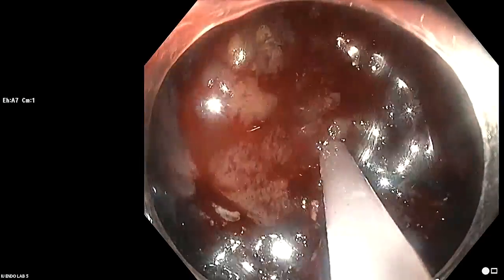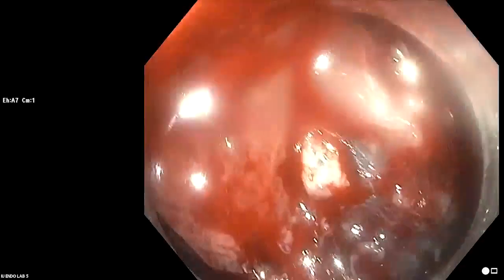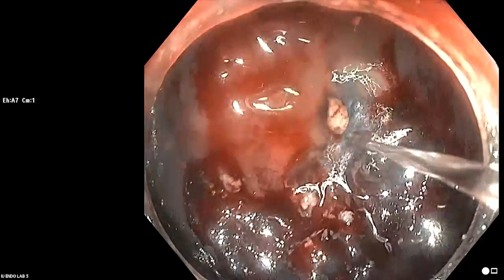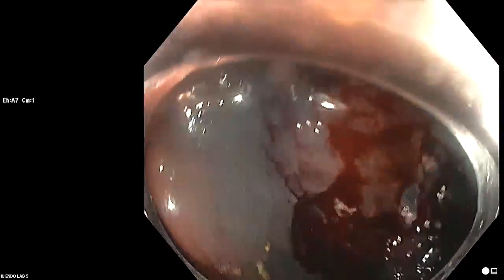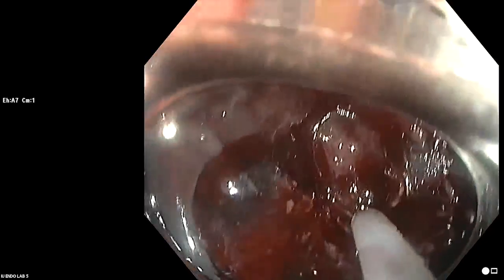The evidence is that these little cords of submucosal tissue, when you pull through, like that one, I didn't pull that through, but it still got a little bit of a submucosal cord, that those are very unlikely to have residual polyp on them.